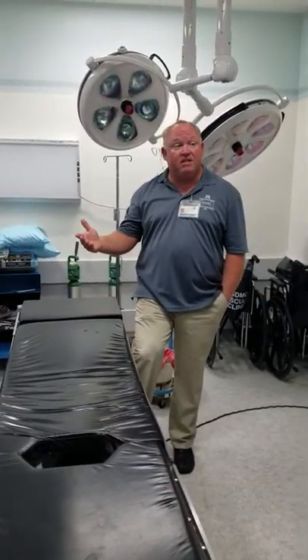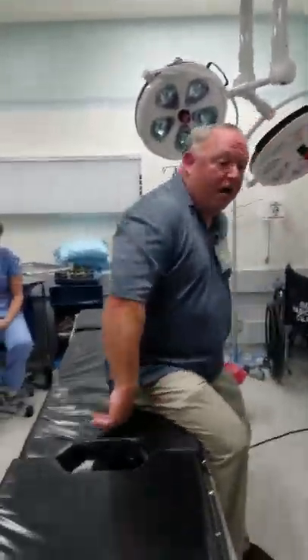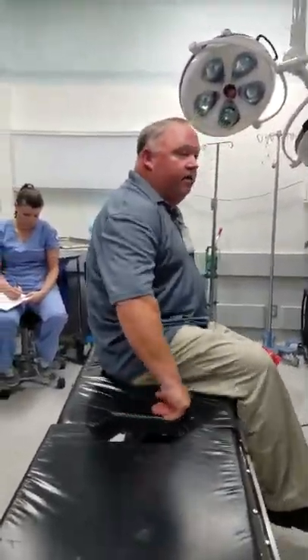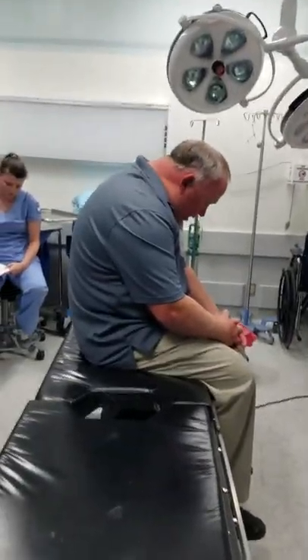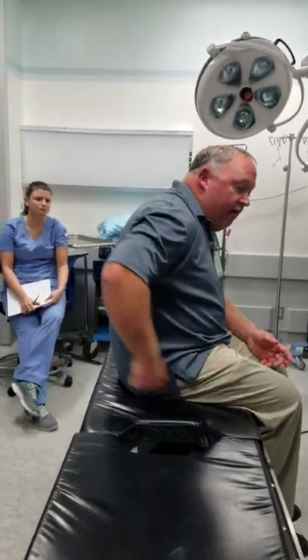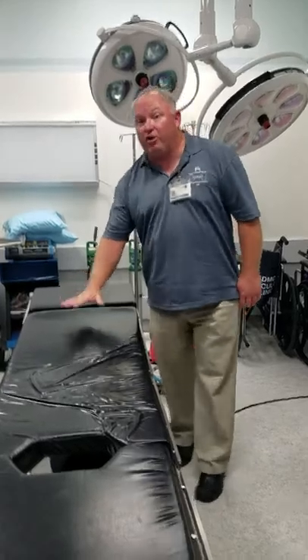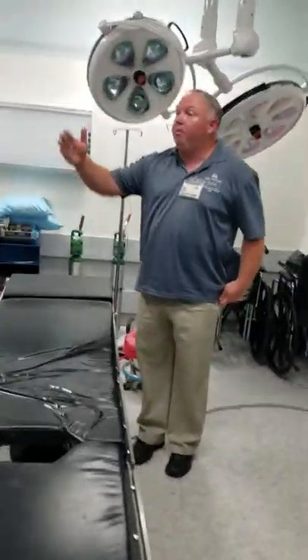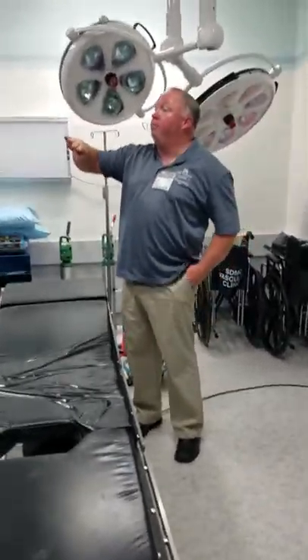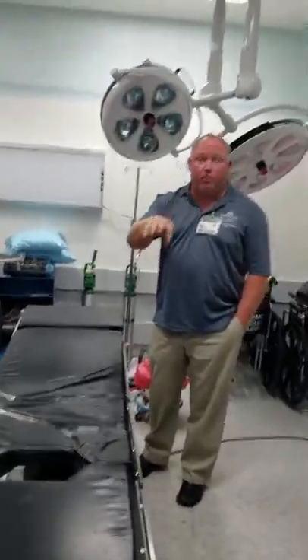They'll either be put on their side to get a spinal, or they may be sat up on the side of the bed. Most commonly, they're sat on the edge of the bed and hunched over — we call that the 'angry cat' position. They hunch their back out, drop their head and chin down, and the anesthesiologist finds the spaces in the spine and puts in the spinal. Once that's done, the patient is supine. I'll put them lateral with the affected side down so the spinal gets to the correct side.